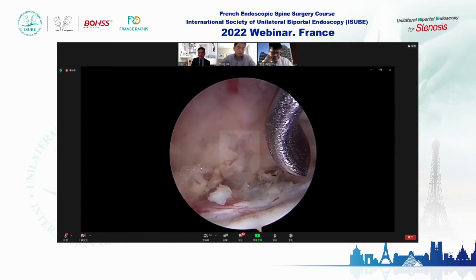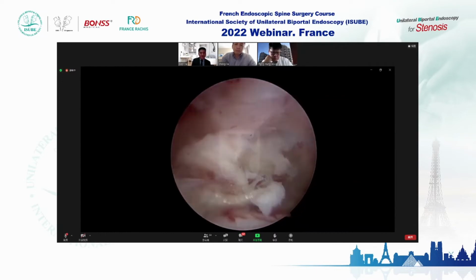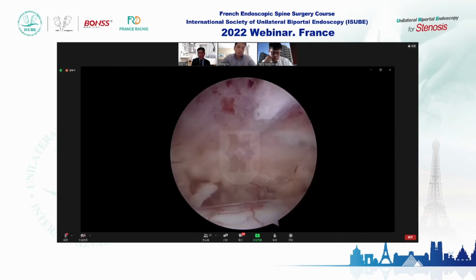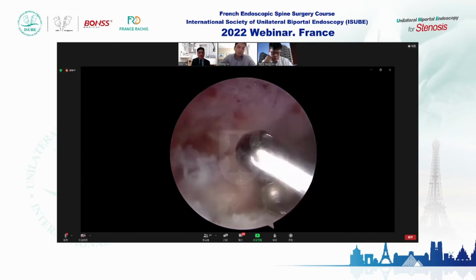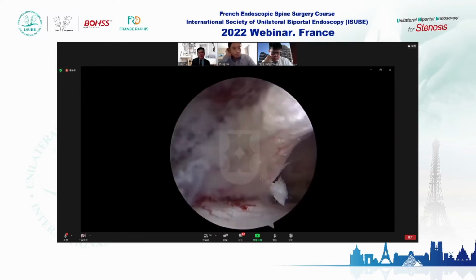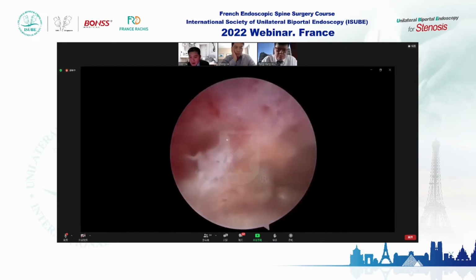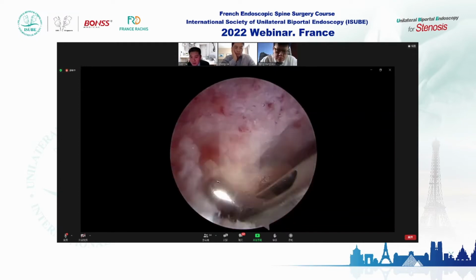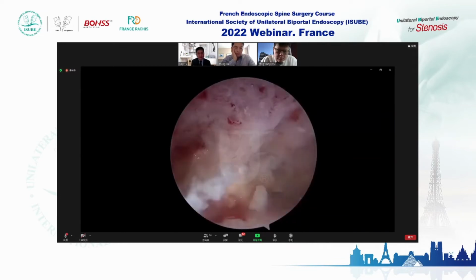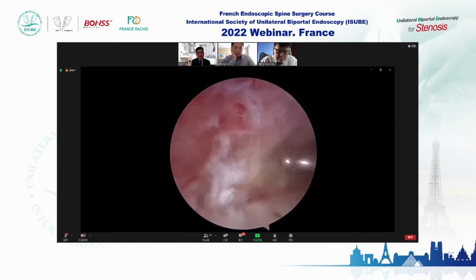Good job. 我可以看到这个膜，我可能已经把椎间孔区域游离的髓核摘除了，但是我需要再去探查一下出口神经根，因为我们看到左侧的膜底下已经是空了。There is too much fat tissue and blood vessel in the axillary area of the exiting nerve root.